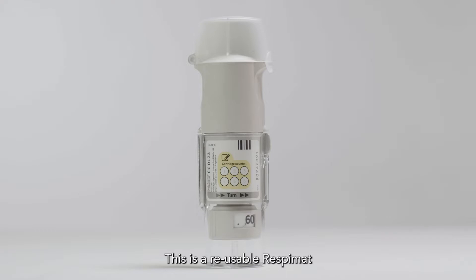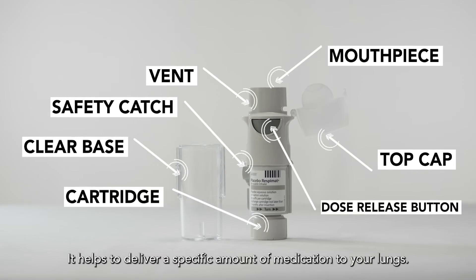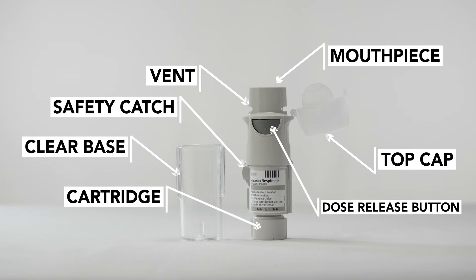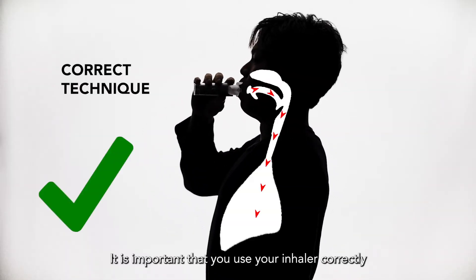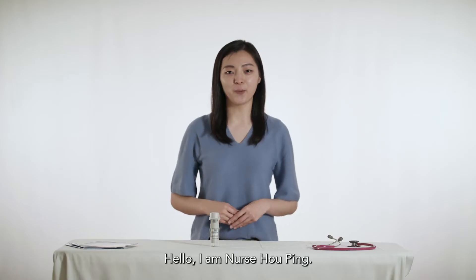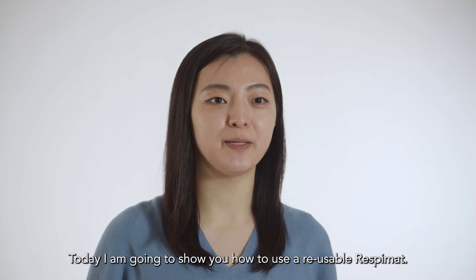This is a reusable respimat, a type of soft mist inhaler. It helps to deliver a specific amount of medication to your lungs. It is important that you use your inhaler correctly, so that you can get the full dosage and increase effectiveness of the medication. Hi, I'm Nurse Ho Ping. Today I'm going to show you how to use a reusable respimat.